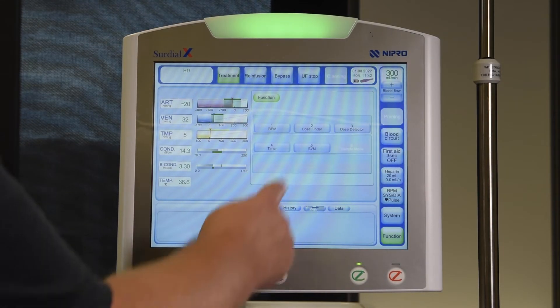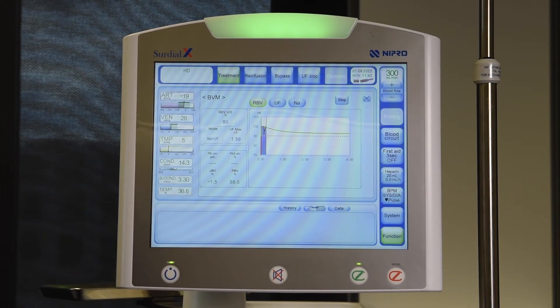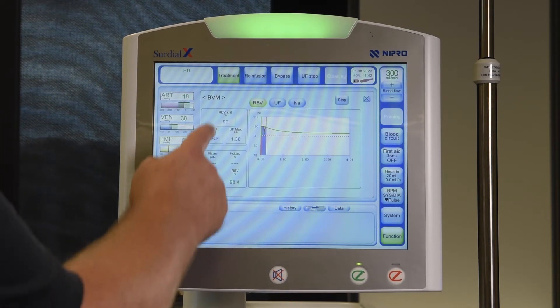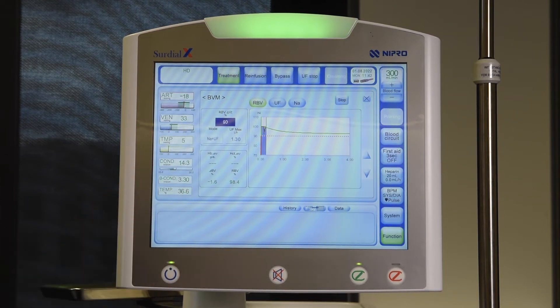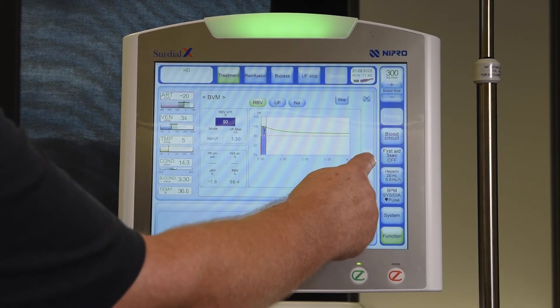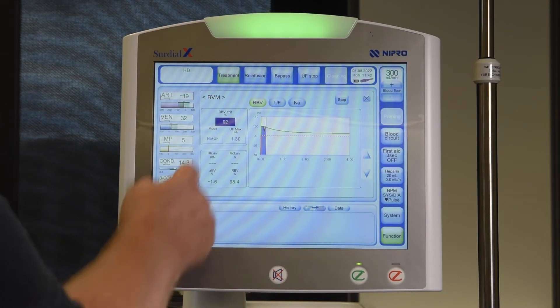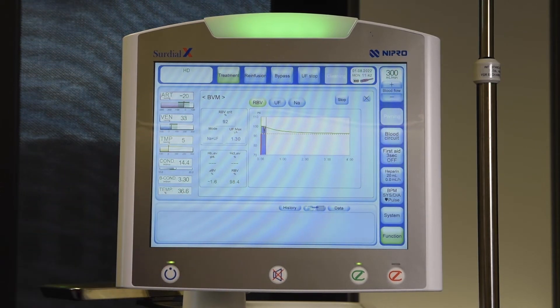To see the BVM parameters during treatment, press Function and BVM. The RBV crit can be adjusted at any time. Use the arrow keys appearing on the right to change it. To confirm, touch the number again.